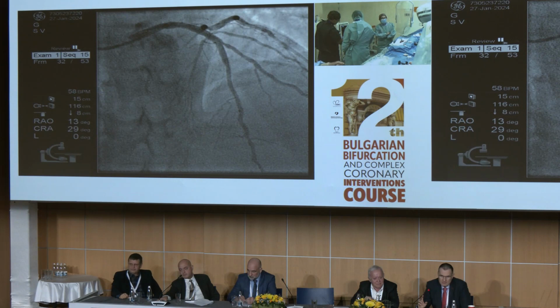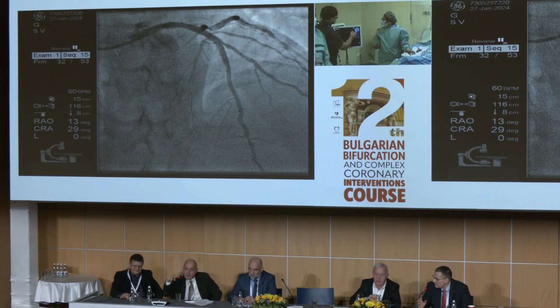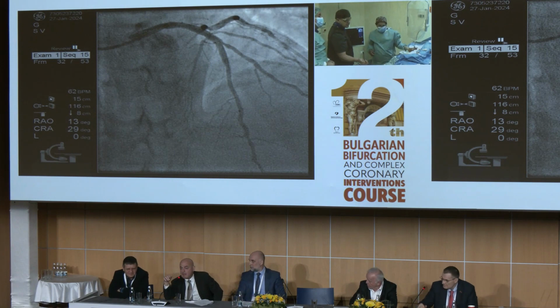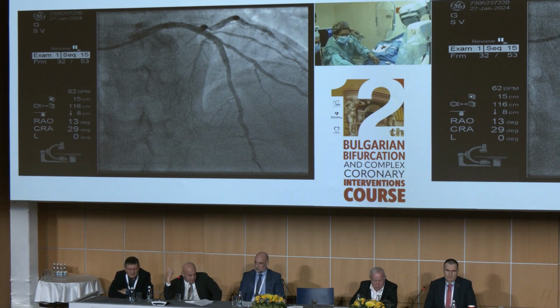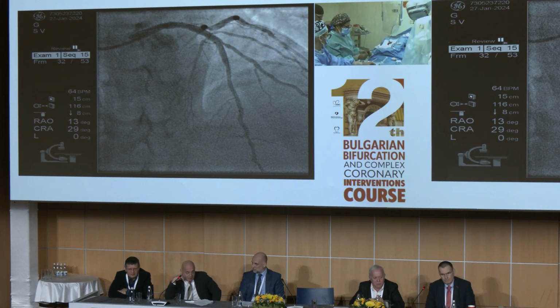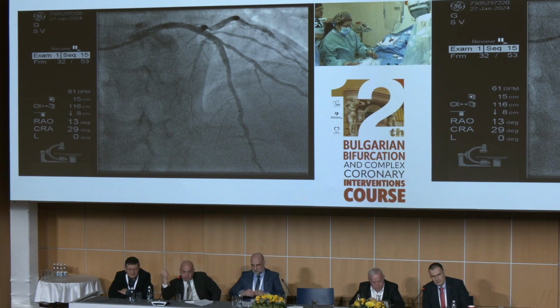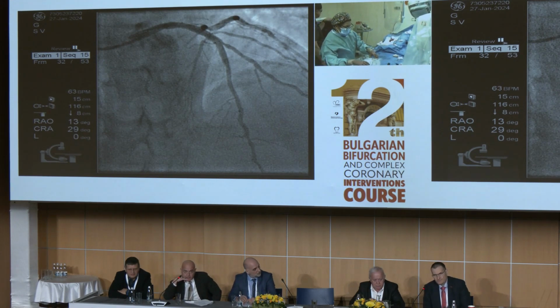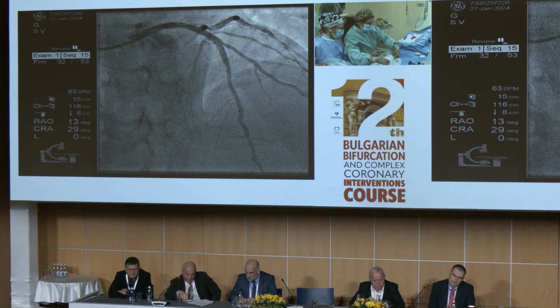I think that any further action could only make the results worse than now. I also agree, but can we see again the IVUS at the zone of the bifurcation, the ostium of the diagonal branch on the previous IVUS, just to stop there and see it better? The last IVUS, pre-PCI? The last one, yes, the zone of the bifurcation, exactly.